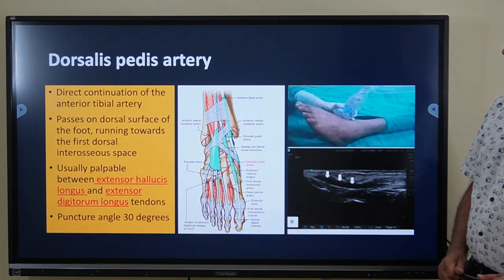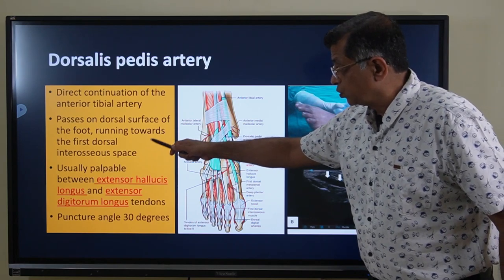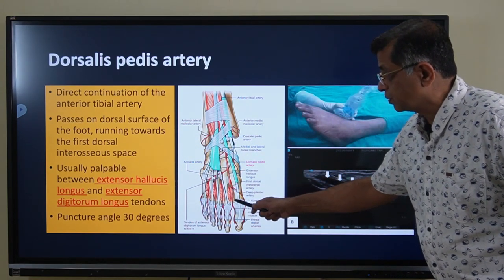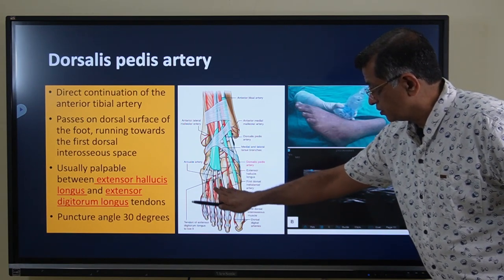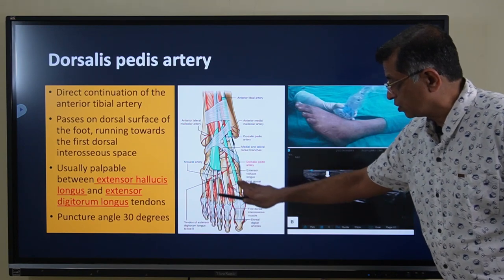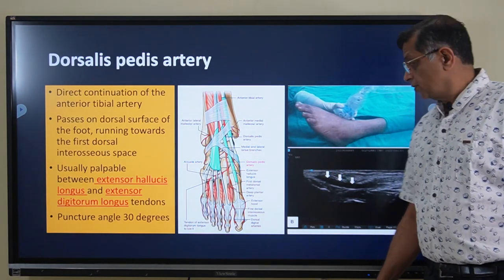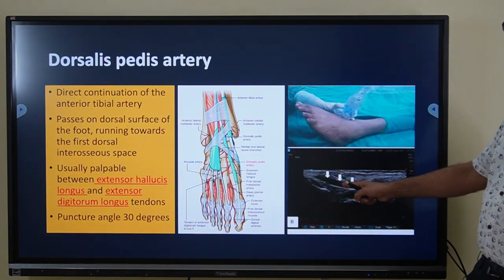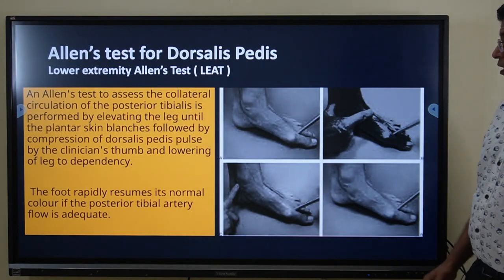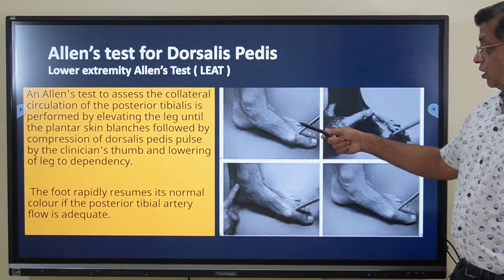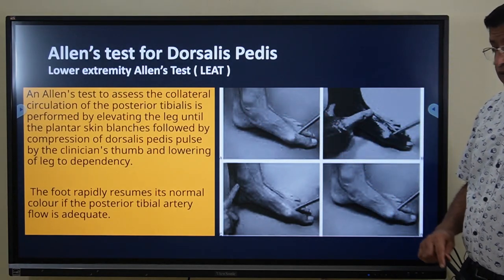The dorsal pedis artery is a direct continuation of the anterior tibial artery distal to the ankle joint, running on the dorsal surface of the foot toward the first dorsal interosseous space. It is usually palpable between the tendons of extensor hallucis longus and extensor digitorum longus — just lateral to the extensor hallucis longus tendon. Ultrasound with a linear probe is helpful. The needle is inserted at 30 degrees. A modified Allen's test for the dorsal pedis can be performed by pressing the posterior tibial artery and observing for blanching, then releasing.